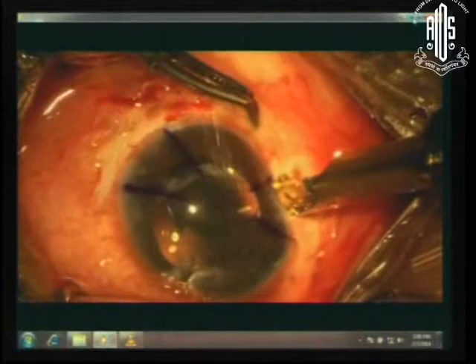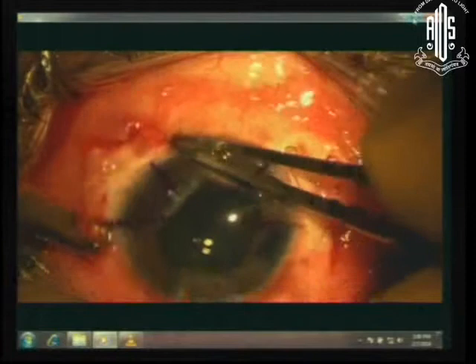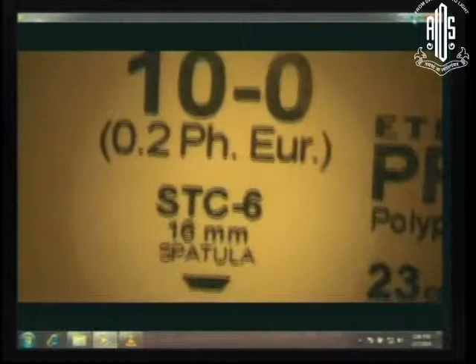This is the tip of the diamond knife. All we now need to do is hold it and run down at the edge of the iris on the limbal zone. Basically we have made a limbal incision which is vertical, through which we will now insert a 10-0 prolene suture which is double-armed.